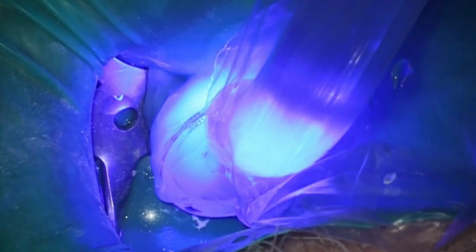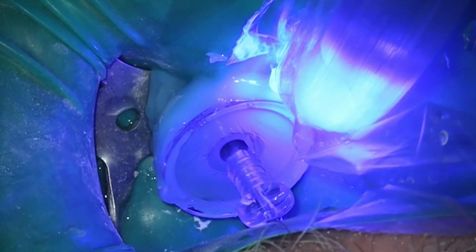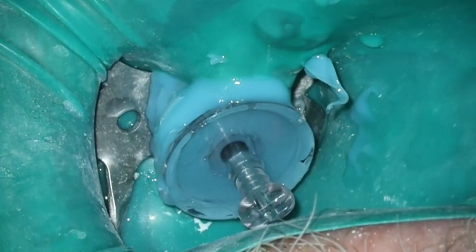Highly recommend using those Glick instruments as well to get a good seal around the outside of this. And then 20 seconds of light here just to get everything good to go. And, do I need the GentleWave in this case? No, we could have done it traditionally.